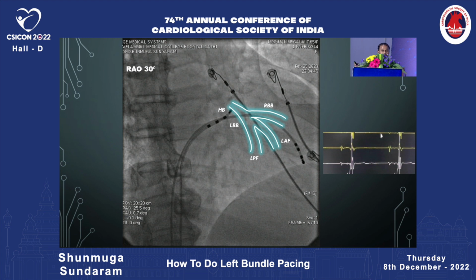If you don't have the luxury of placing EP catheters, take a TPI catheter, place it right at the RV apex, and make it a parabola. Usually the peak of the parabola will correspond to the superior aspect of the tricuspid annulus, or the His bundle.